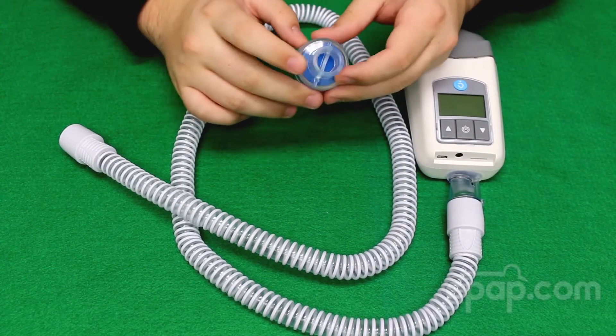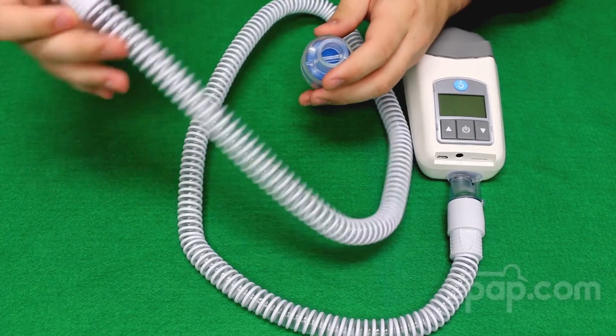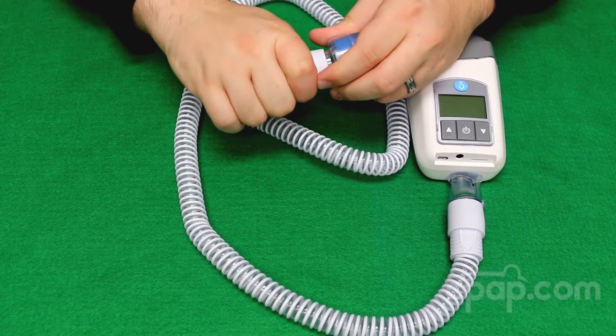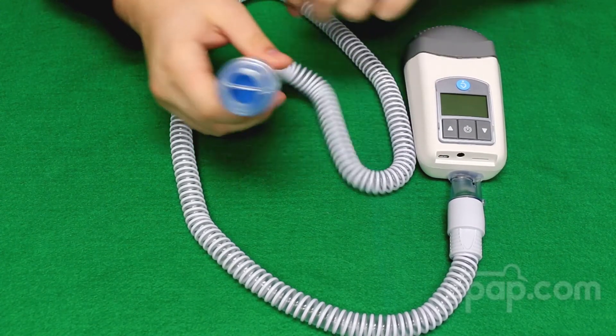You will notice that it has a smaller diameter end and a larger diameter end. The smaller diameter end is what connects to the slim style hose of the Z1 machine, and then the larger diameter end will be connected to a CPAP mask and it will be ready for use.